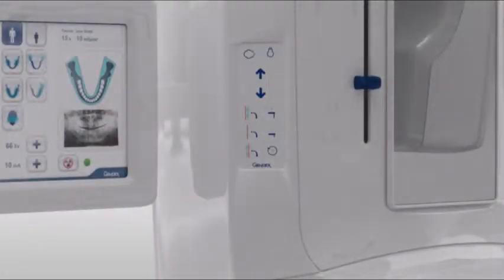The column control has buttons for patient in, laser alignment lights, carriage up and down, anterior posterior movement, chin rest up and down, and finally a reset button.